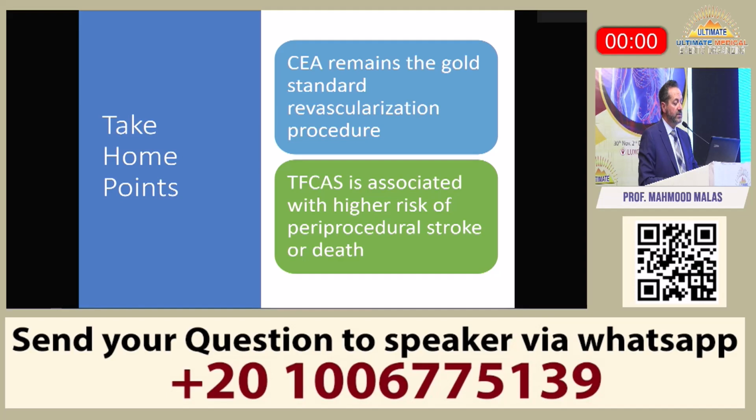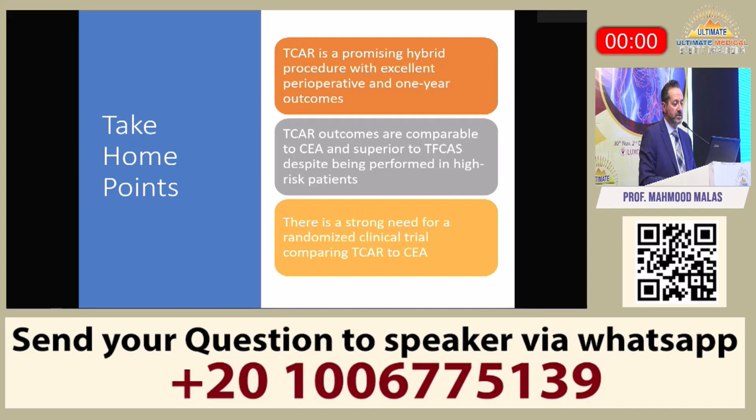So CEA remains the gold standard for revascularization procedures in the carotid. Transfemoral has higher risk, but we can do better by proper selection, as I mentioned in an earlier talk. TCAR is very promising. It's a hybrid procedure that combines the best of both worlds, transfemoral and CEA. And the outcome so far is much better than transfemoral, but similar to CEA.